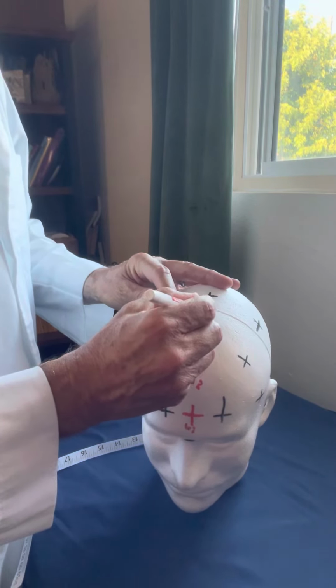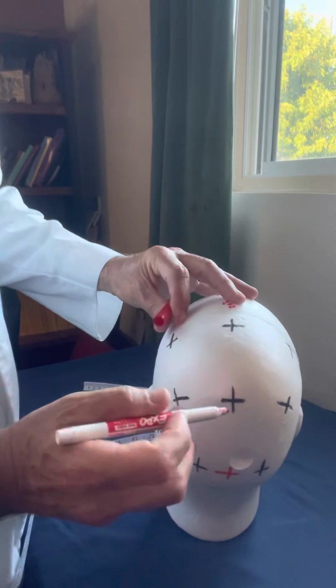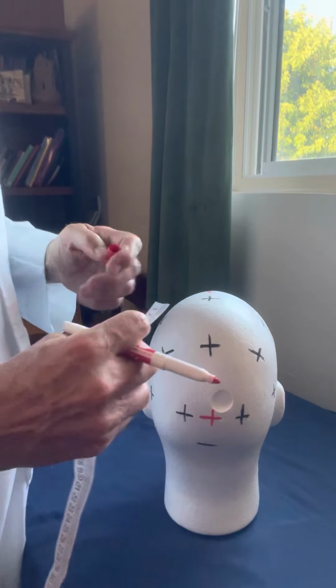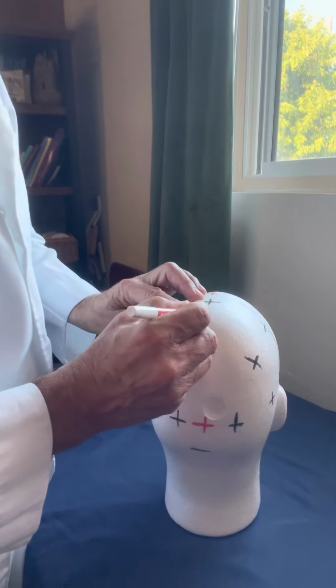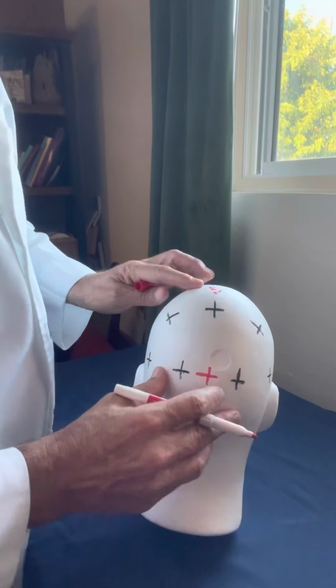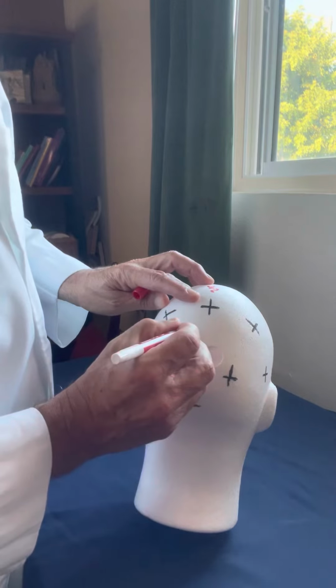Okay, so it's 20% there. From CZ to PZ, it should be 20% of the nasion to inion distance, and this is 7 centimeters exactly. So that's good. And from PZ to OZ, it should be 20%.